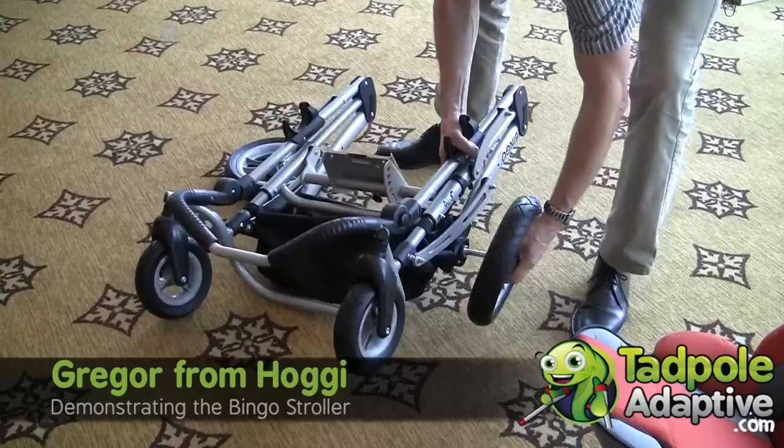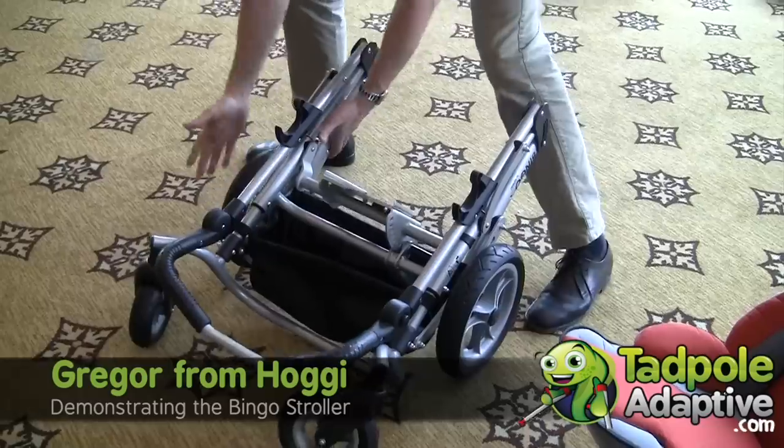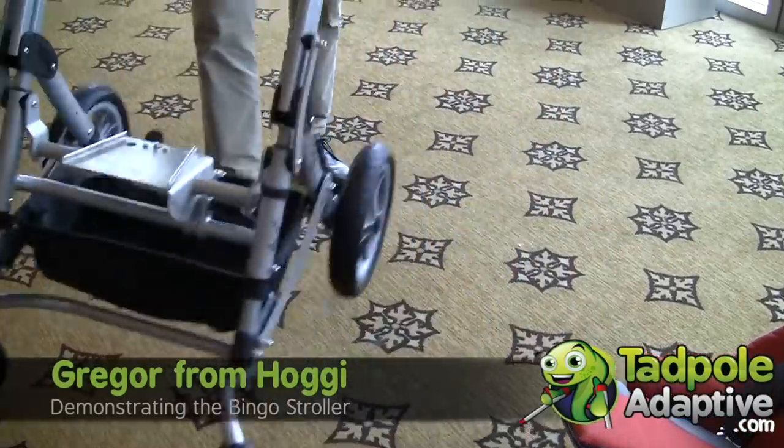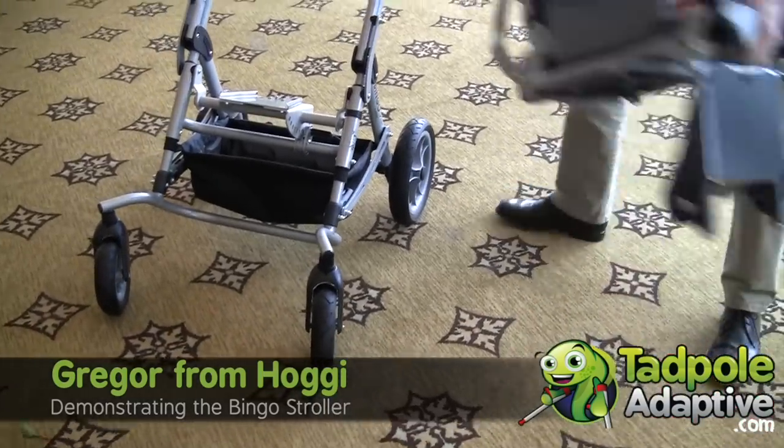To get it back up, we just pull, and put the seat on again.